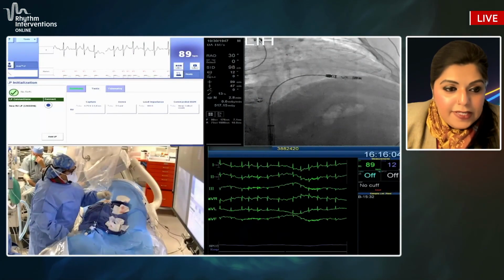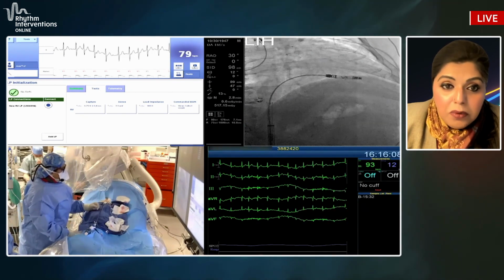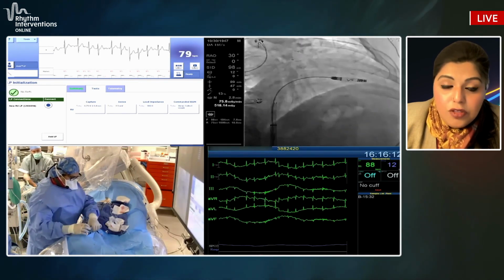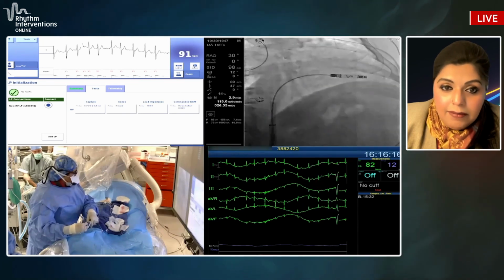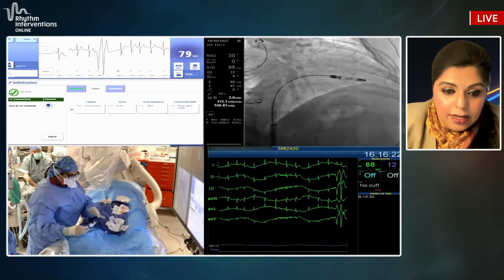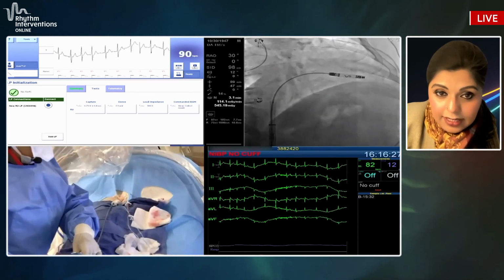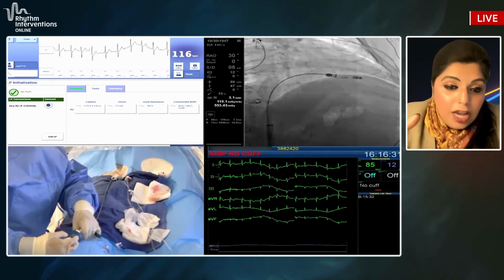So in the previous segment, I showed you that we had decided this was a good location. We had good numbers. So at this point, we're getting ready to fixate. The first thing I'll do is take a cine image to know what direction my chevron's pointing. Once I have the chevron mapped out, I'll know how much I'm turning.